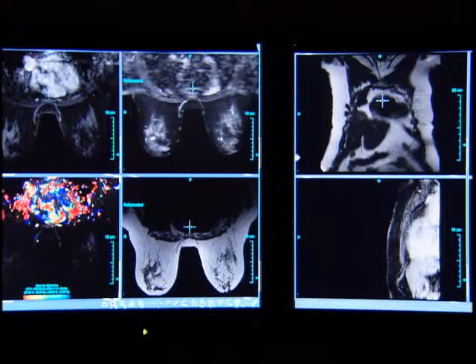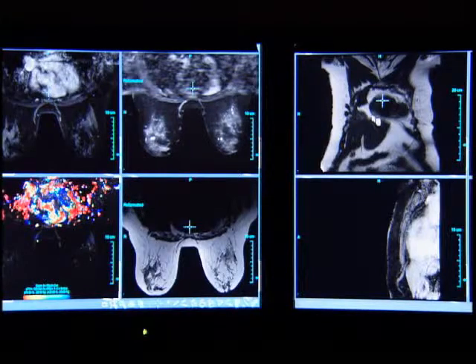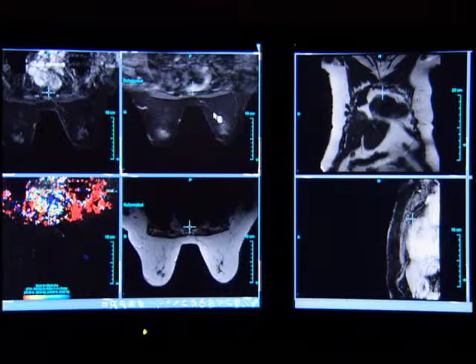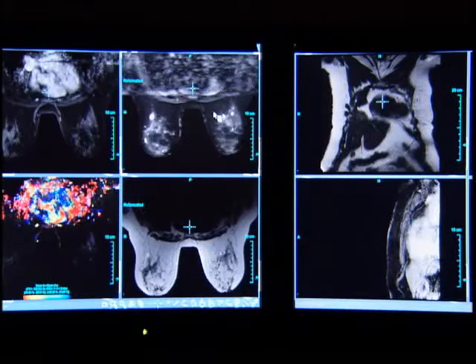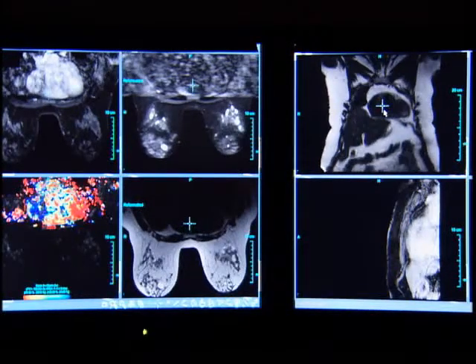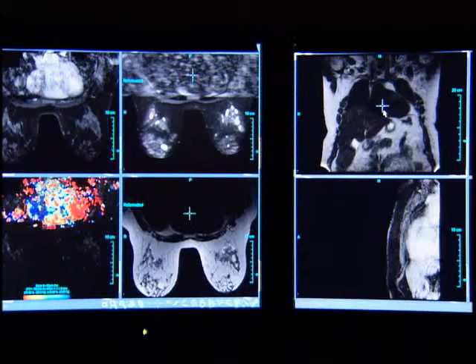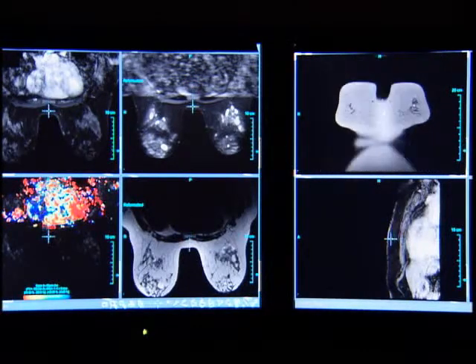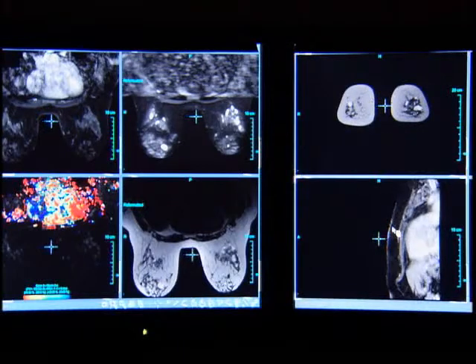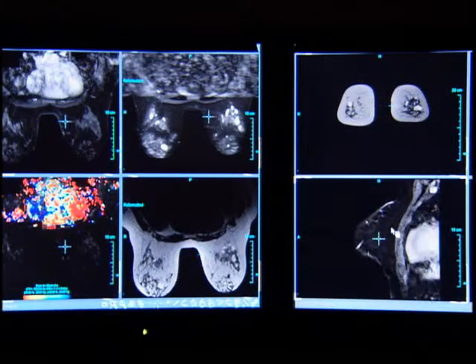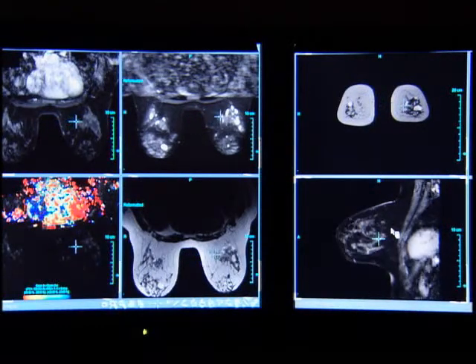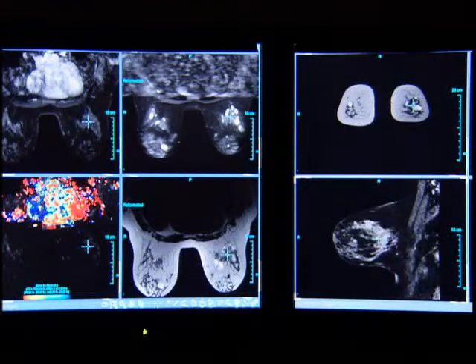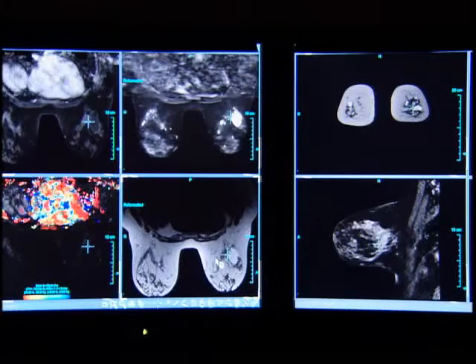Also with this pull-down menu, you can see the ability to cross-correlate with multiplanar imaging. As we navigate through the axial plane, you see your location on an orthogonal coronal acquisition. Additionally, a sagittal high-resolution fat-saturated imaging sequence can be correlated with lesions seen in the axial plane.